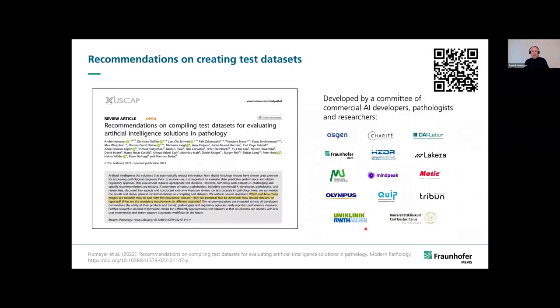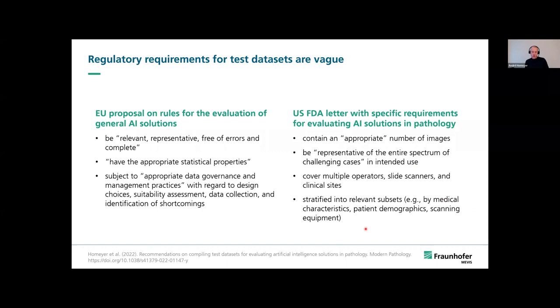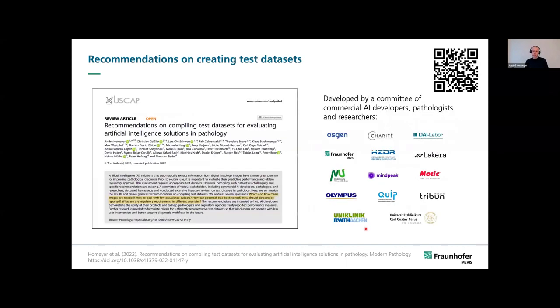In general, there is a lack of literature and guidelines for compiling test data sets for AI solutions in pathology. And as just stated before, the regulatory requirements do not really help a lot because they are too vague.